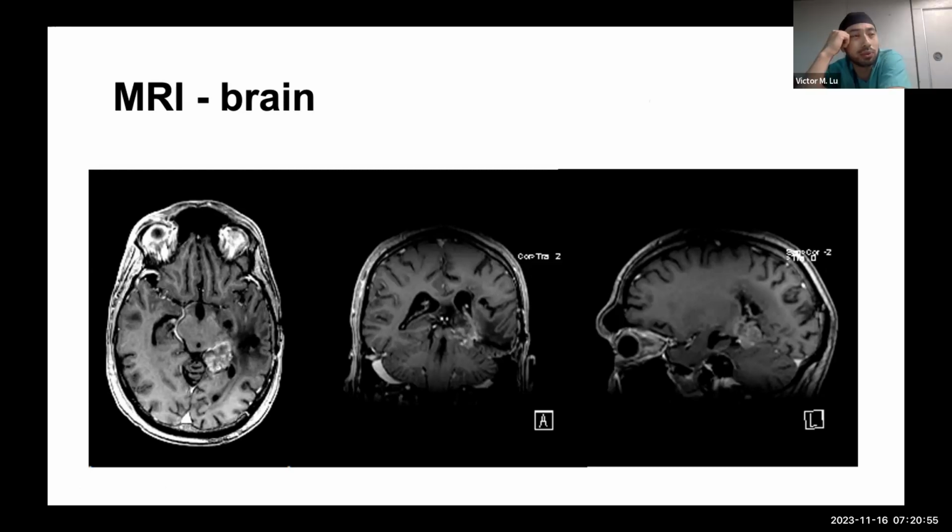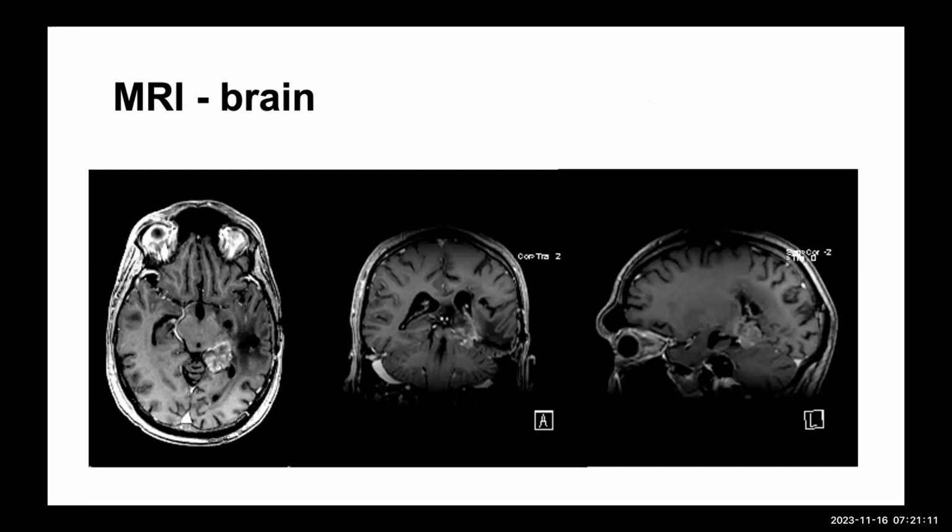What else could contribute to right lower extremity symptoms if it's not in the brain? It could be in his cord. The other thing you can see here is it looks like some of the sulci may be mildly enhancing here, but I can't really see completely. If he has leptomeningeal disease, it could spread down to his cord.